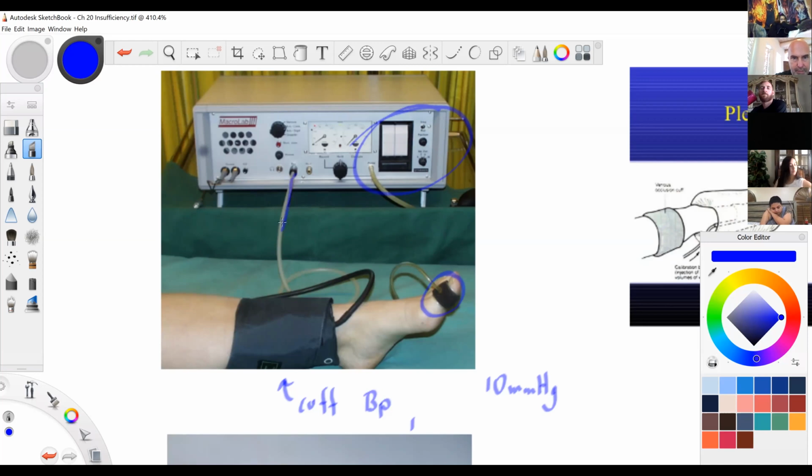Pressure comes in from the machine into this toe cuff and expands the cuff. It can hold that expansion indefinitely, as long as there are no leaks. With arterial, we can actually see a pressure wave going back, and with an arterial plethysmography, we actually get a waveform, similar to our Doppler waveforms. Of course this isn't Doppler, this is literally pressure, but it's the pressure from the same thing that causes Doppler, which is our pulse, right?